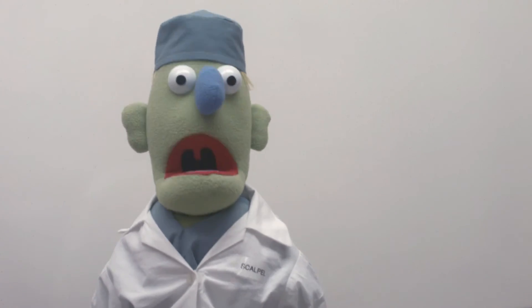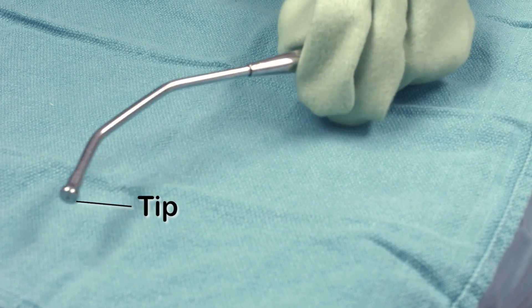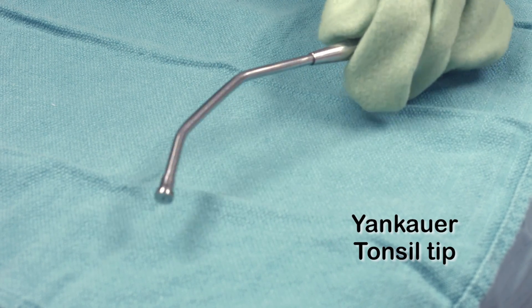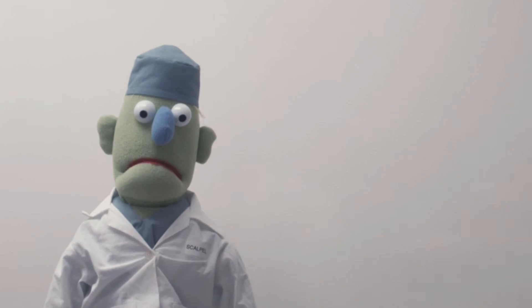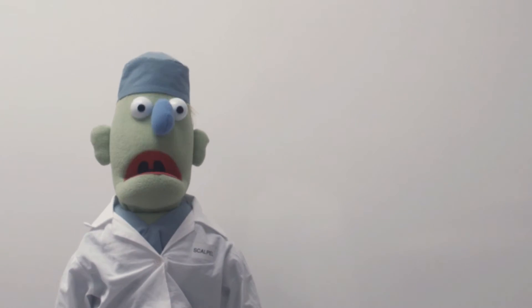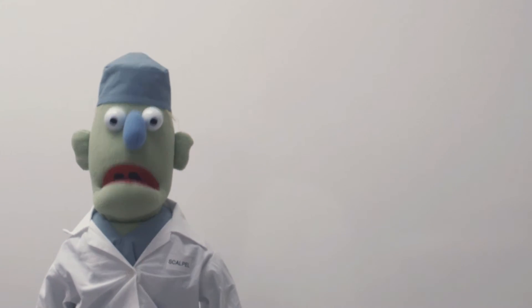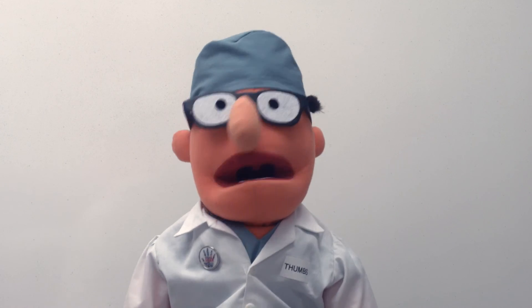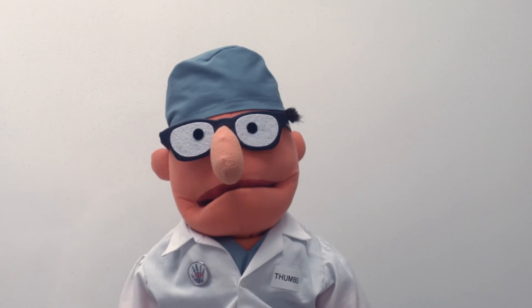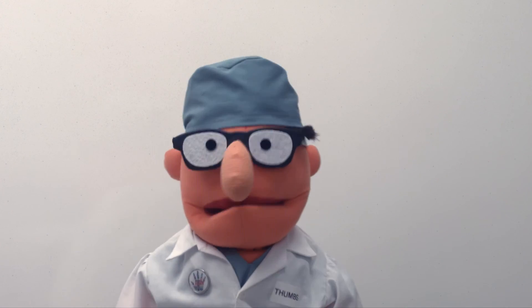There are two main ways of using the sucker. The first is for sucking up blood that's in one particular place. For this application, you'll use a sucker with a tip on the end, like a Yankauer or a tonsil tip. These only suck at the end of the instrument, so you have to touch them right where the blood is. There's an art to sucking, and it takes a while to get good at it. If you leave the sucker in the operative field all the time, it gets in the way. If the sucker is moving around all the time, it's very distracting and it can bump into the other instruments. So you have to get your timing right. The surgeon operates a bit, and whenever there's a pause in the action, you jump in for a few seconds and get busy sucking up the blood you can see. Then you get out of the field so the surgeon can operate again. You go back and forth like this — suck and operate — until the stage of the surgery is complete.